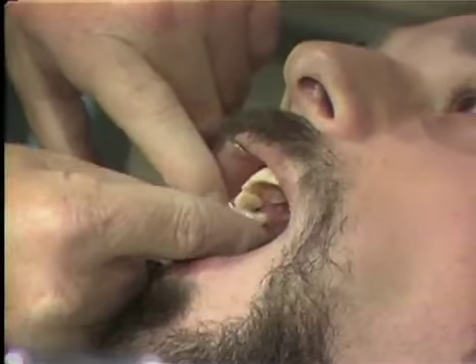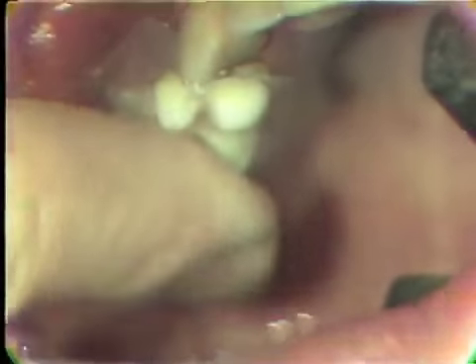With this loaded, we will place it in the mouth over the teeth. Hand close. The patient can bite on it to seat it in the proper position.